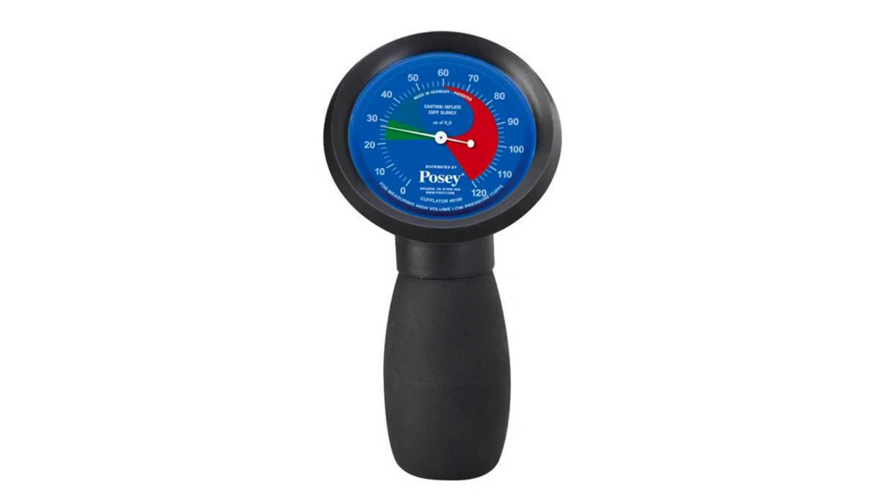What should the pressure be? All we're looking for is enough pressure to seal the airway. That ends up being 20 to 30 centimeters of water.